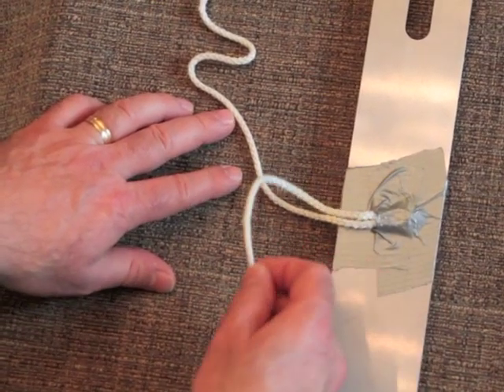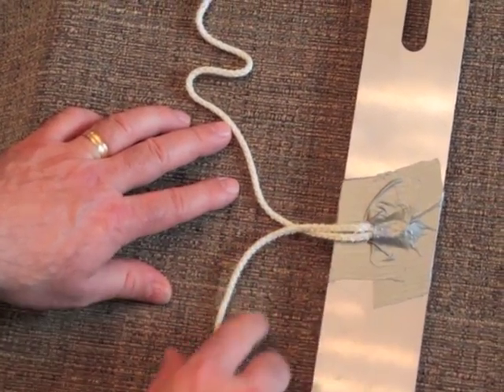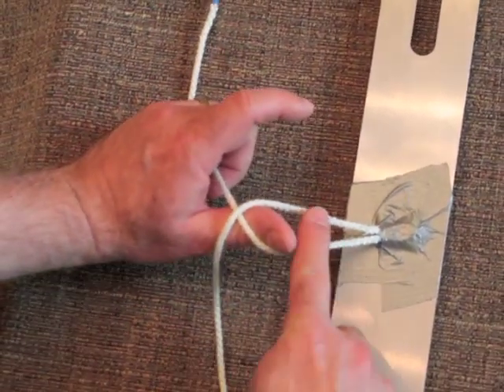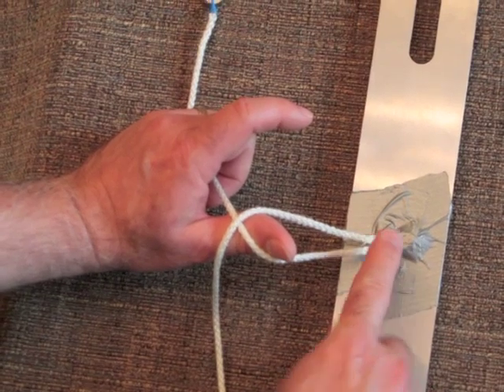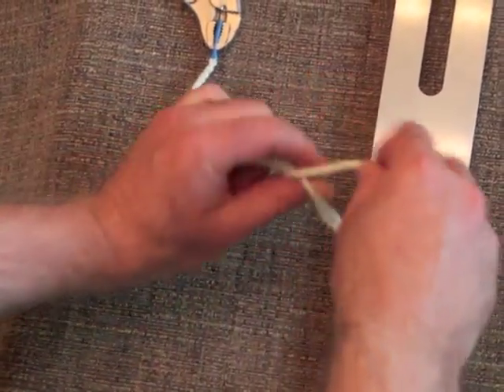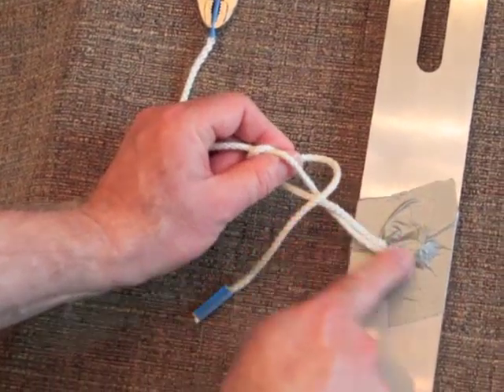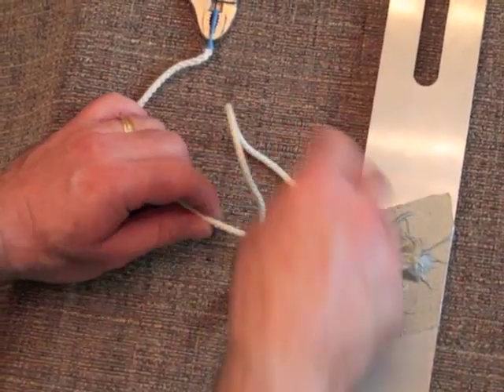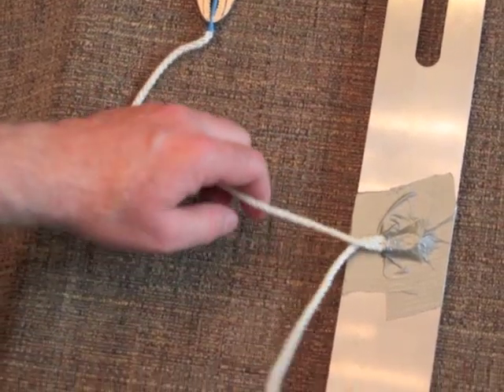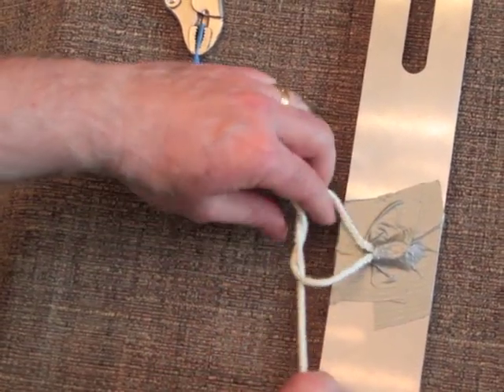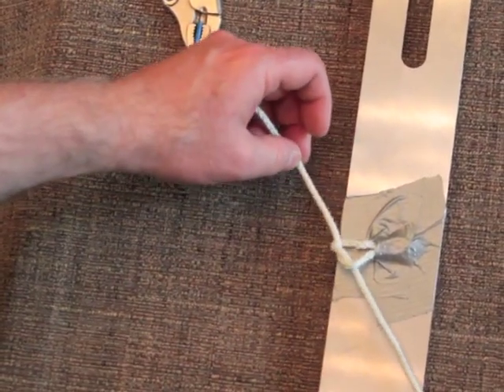The next tip I'd like to review with you is the importance of keeping the first part of the knot open. You may have noticed that Emily had you start with the free end over. And she instructed you to start with your thumb. See how that keeps this end open? If you had started with your finger, the knot would have been crossed up in here. And that's wrong. However, if the suture end should happen to be under, you will have to use your finger to put the knot down flat.